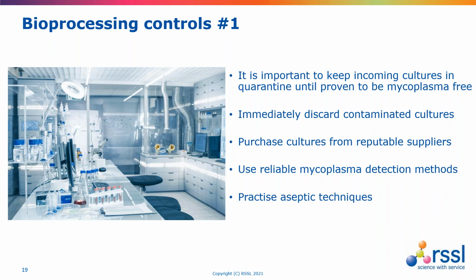And also controls around people. We mentioned aseptic technique on the last slide, but washing and disinfecting the hands of people working with cell cultures is really important, as is wearing personal protective equipment, and also good practices such as restricting speaking at the bench, particularly because of the Mycoplasma pneumoniae factor with people.